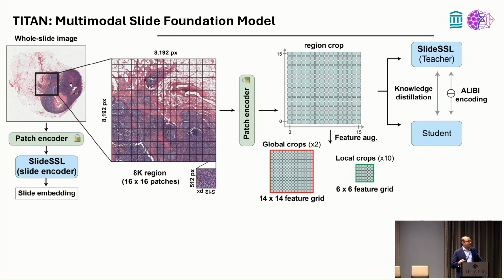But more recently, we've expanded this into a much larger study where we used all of the data that we had available, but had 3-stage training. So we used a number of different things we had learned from the PRISM models, but also some other tips and tricks that were being used by the large language model community, like training short and testing long. So training on a smaller region within the slide, and then testing on a much larger region. So this was 3-stage training.